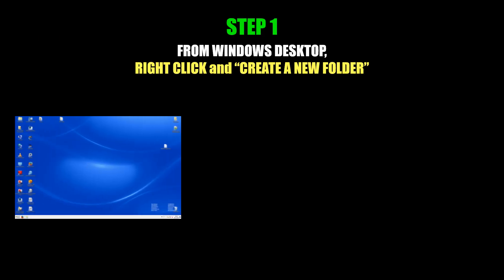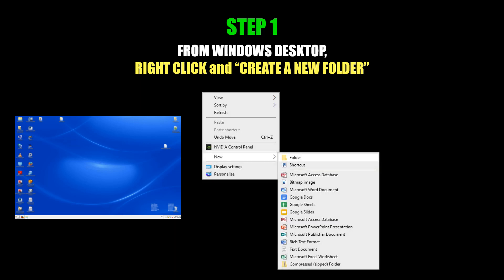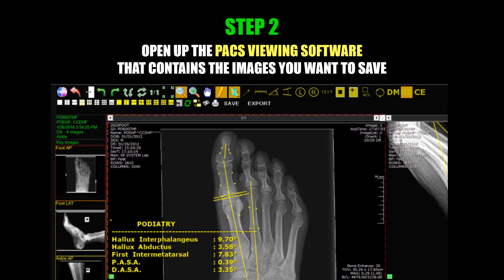In order to save your images in DICOM format, the first thing I recommend is going to your Windows desktop, right-clicking, and creating a new folder. The second step is to then open up the PACS viewing software that contains the images that you want to save.